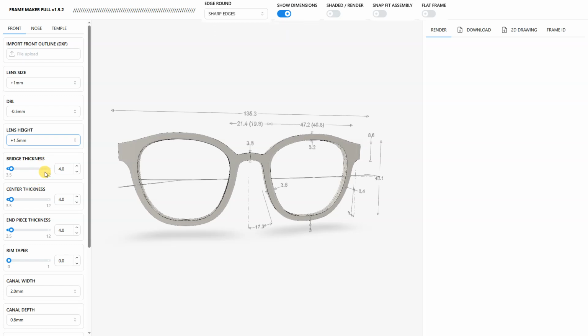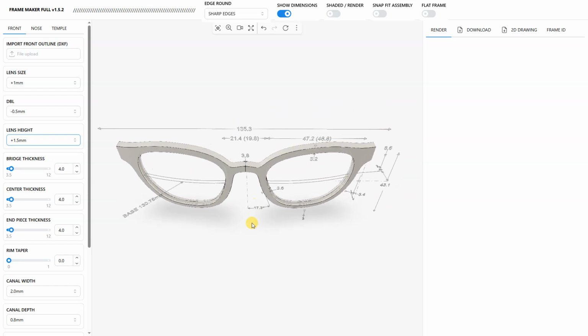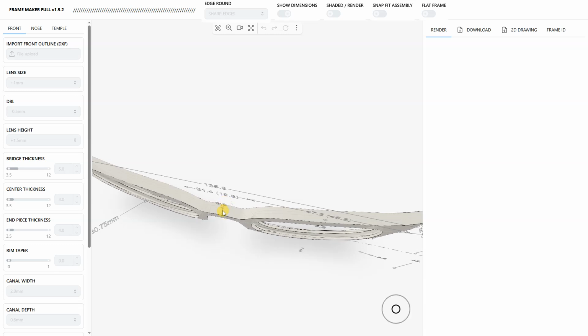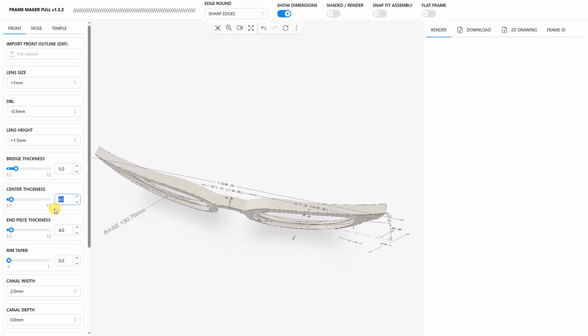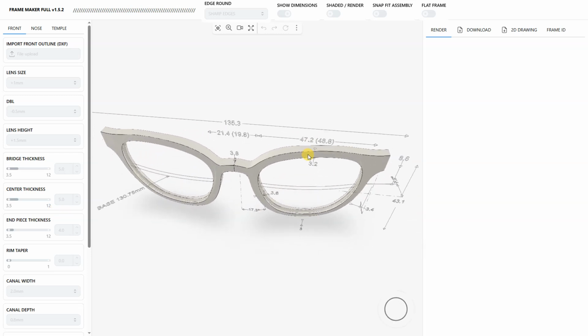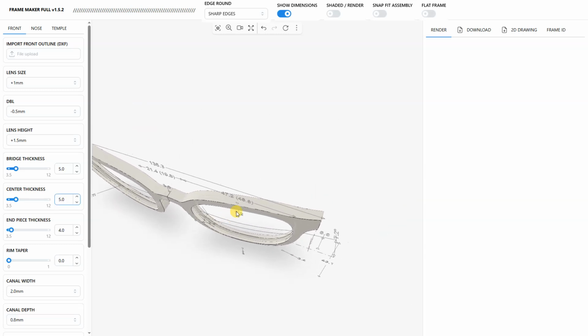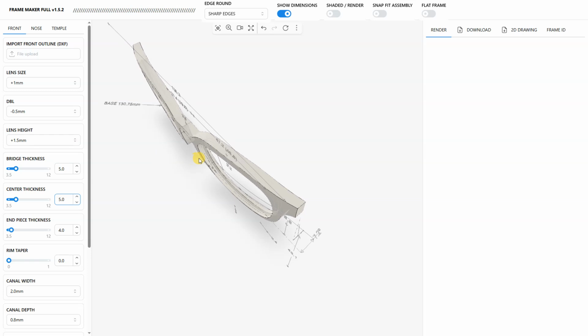Then let's go to bridge thickness. There are three areas that we can alter the thickness. So the bridge thickness, let's say it's 5, it's going to be the thickness here at the bridge. So it's going to jump from the default 4, there it is 5. Let's do 5 in the center. The center of the lens, that would be about there. So there it is. I moved it right at the moment that it updated. And now the end piece thickness, which is here, let's say I want 5.5. So maybe that has to do with the temple or hinge or whatever I have to work on here.